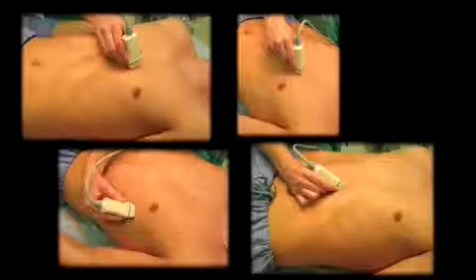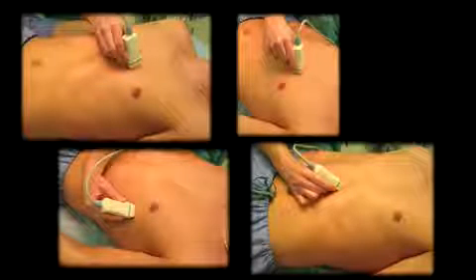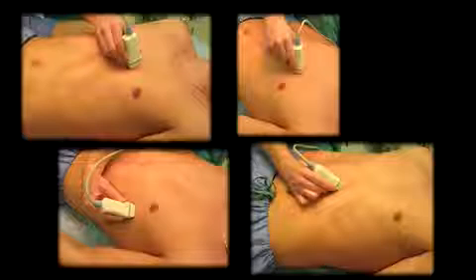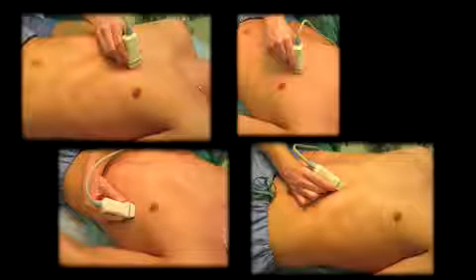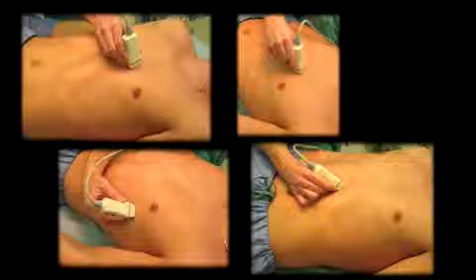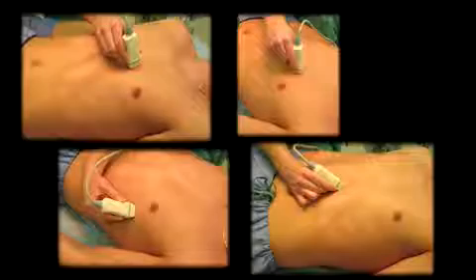There are 4 common probe positions, or views, used for bedside echocardiography. It is important to learn how to obtain all the common echo views because in any given patient, one view may provide excellent information while others are useless. Also, on any given patient, it is impossible to estimate which view will provide the best information.